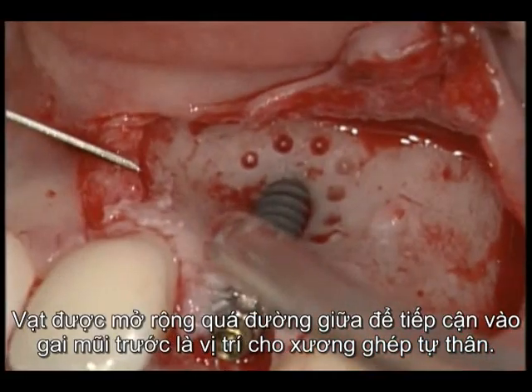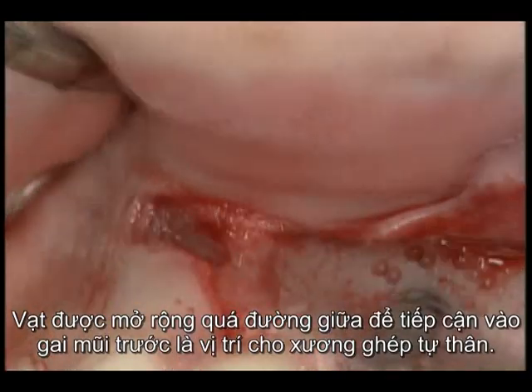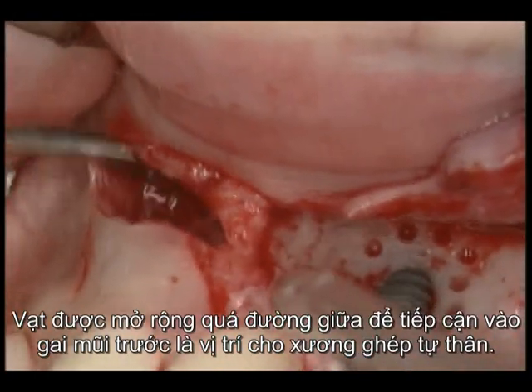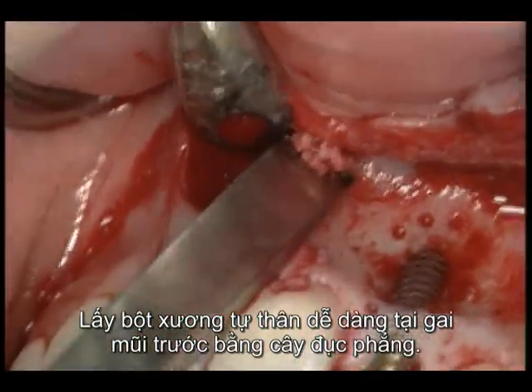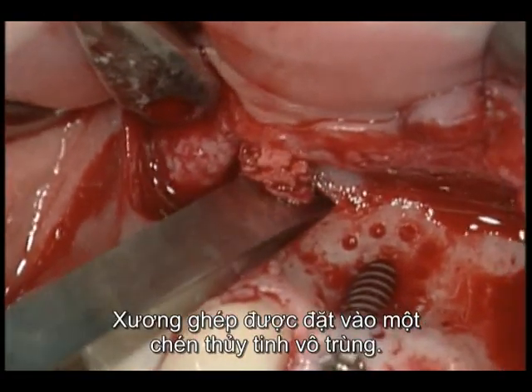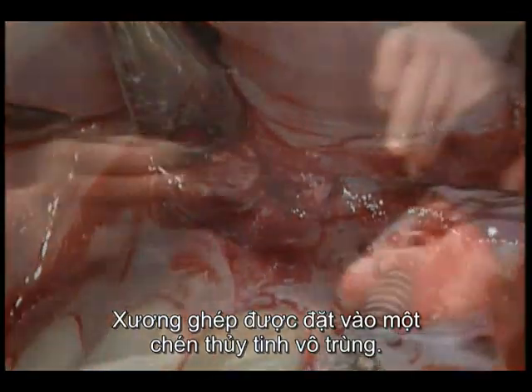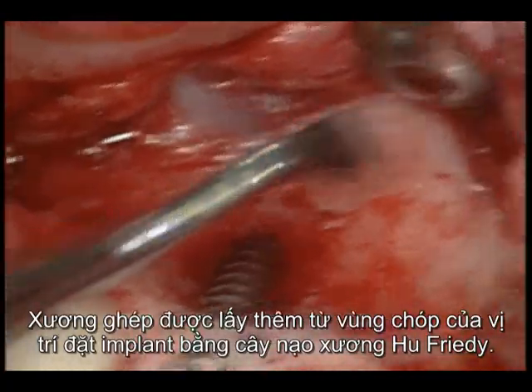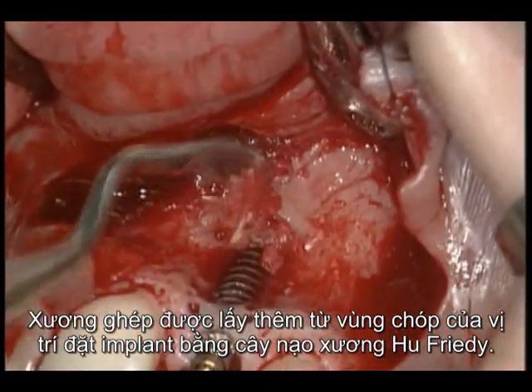The flap is extended beyond the midline to gain access to the nasal spine as a donor site for autogenous bone chips. Autogenous bone chips are easily harvested using a flat chisel at the nasal spine. The grafts are collected and placed in a sterile glass dish. Additional grafts are collected from the apical area of the implant site with a Hugh-Freedy bone scraper.